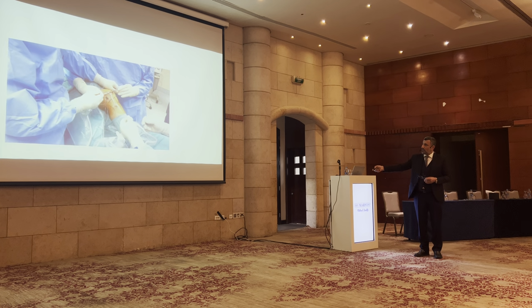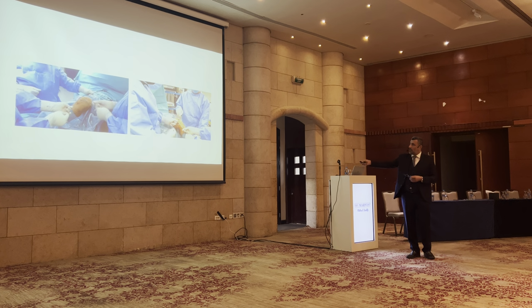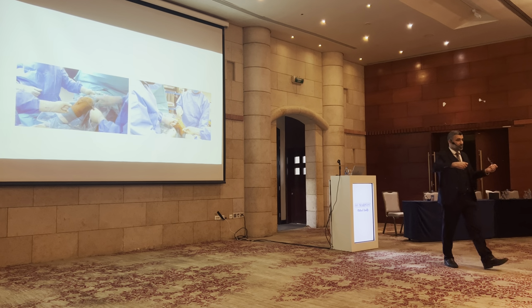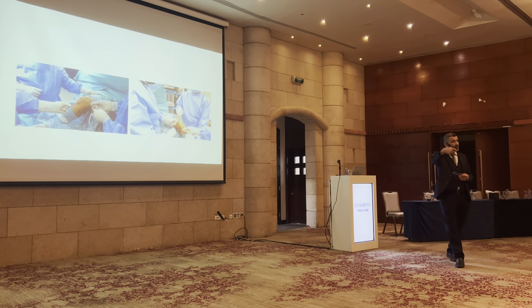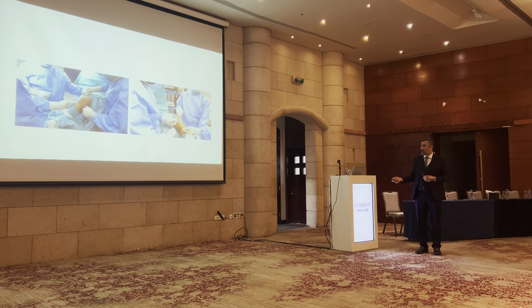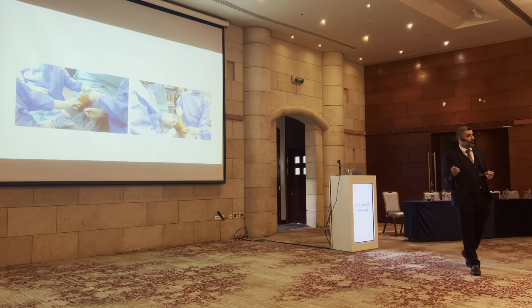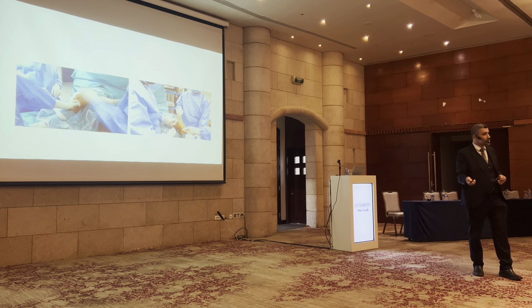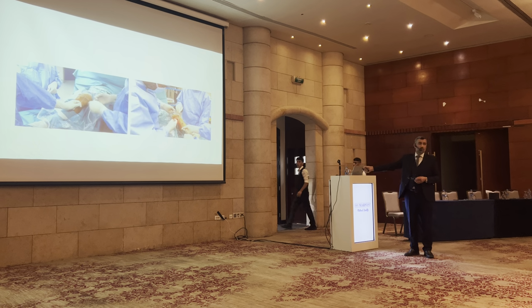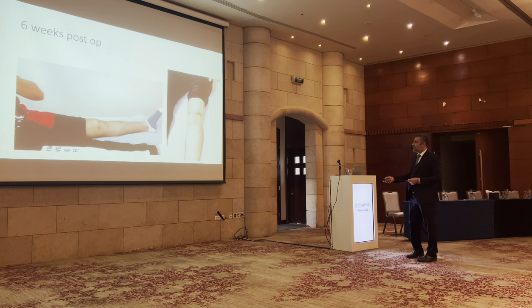We pass it. It's like parachuting of the graft. You see, when we tension the suture, how strong. And now, we make a small incision on the other side, and we tie the suture. So this is an intraosseous sling with no anchors. We have done, I don't know the number exactly, maybe 50 cases. Alhamdulillah, we don't have any case of failure. Not because of technique only, because we deal with the associated predisposing factors. Look how strong. I would be worried if I had anchors pulling out like this. And okay, this is the patient at 6 weeks.